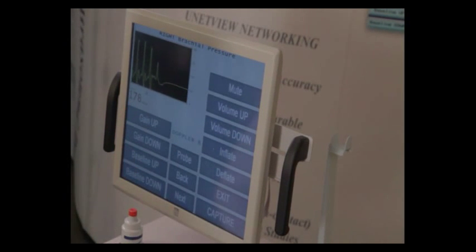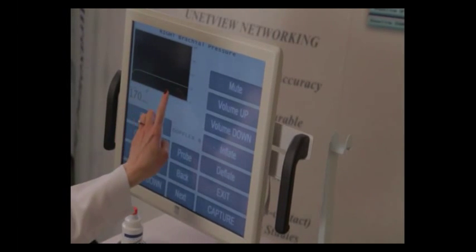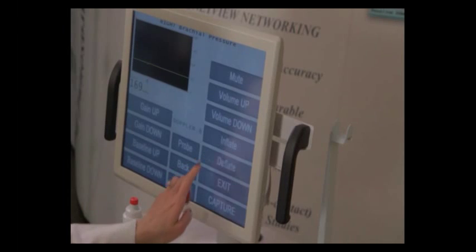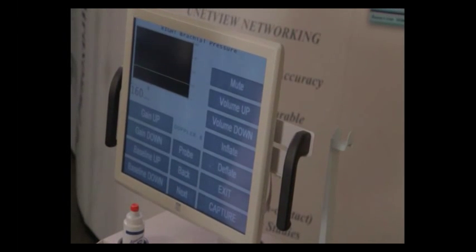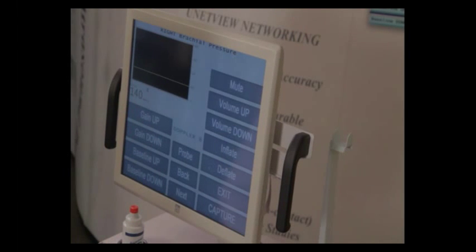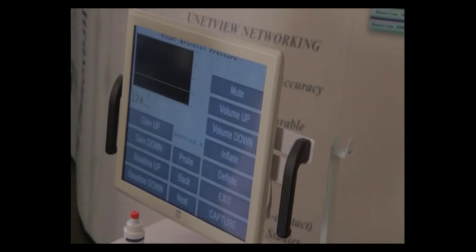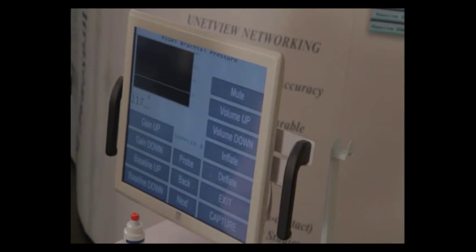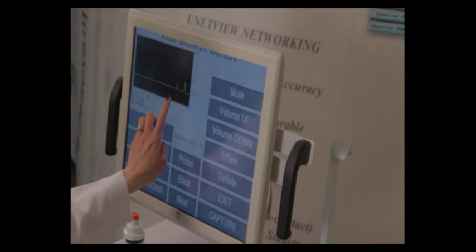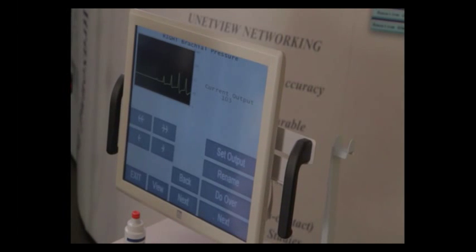Okay, we've now occluded the vessel as evidenced by the pressure of 175 and a flat line, and we're now going to press the deflate button once. You'll see the numbers going down on the screen, and when the pressure in the cuff is lower than the patient's peak systolic brachial pressure, the sounds from the Doppler will be heard and seen again. I like to wait until I hear 3 or 4 beats before pressing the capture button.